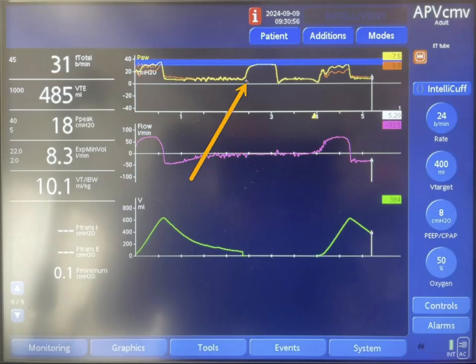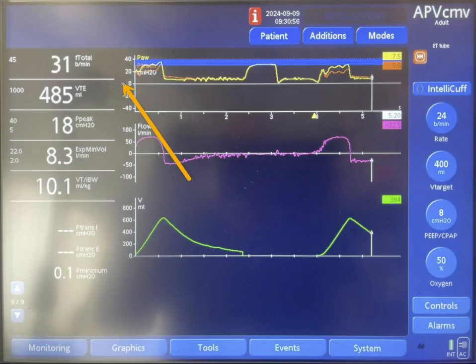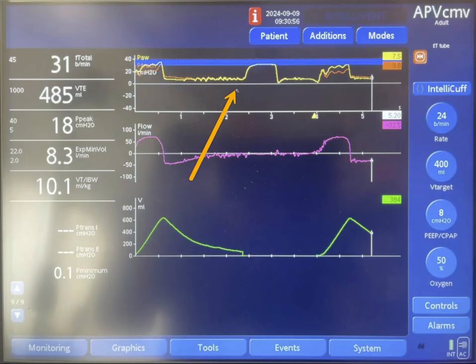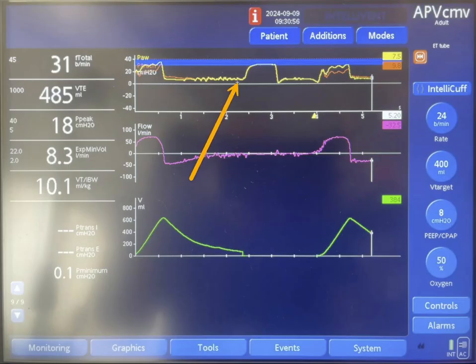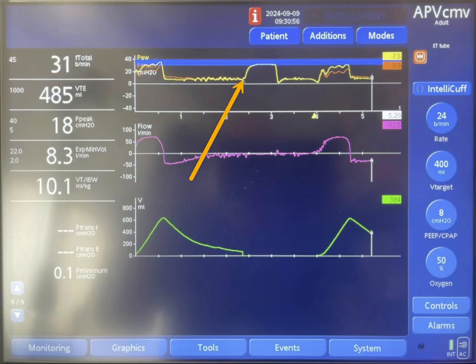This is the point where the second breath starts, and it's happening after 2.5 seconds. There are no inspiratory efforts by the patient and no negative deflection. So this is machine triggered, or time triggered.